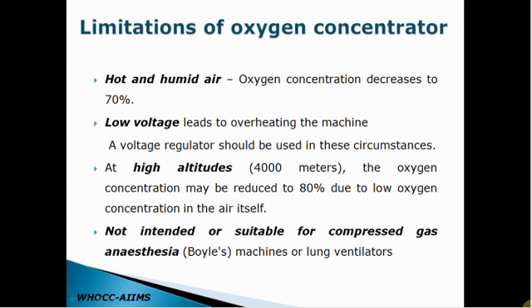Secondly, low voltage may pose a similar problem by overheating the machine due to the inefficient running of the motor. A voltage regulator should be used in these circumstances.